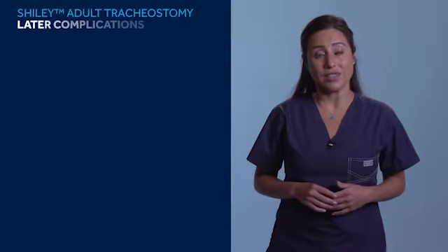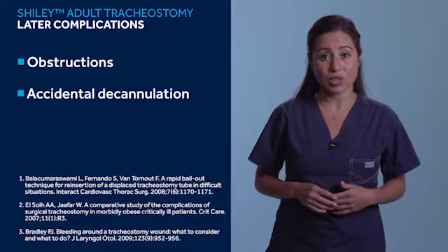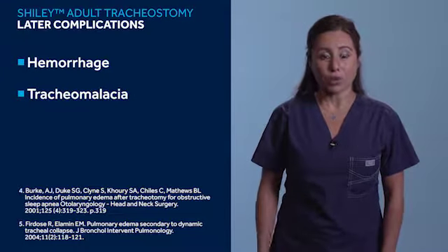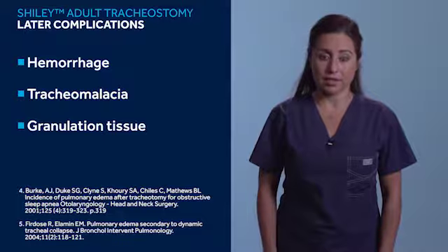Later complications include obstruction by mucus plugs, accidental decannulation, wound infections, hemorrhage, tracheal malacia, and formation of granulation tissue at the incision site and at the cuff site.